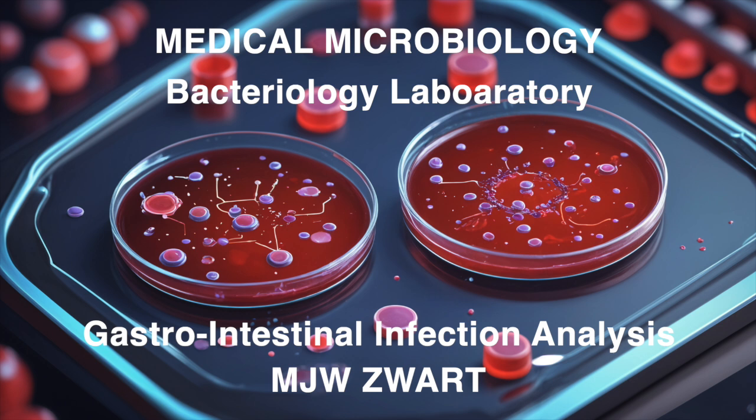Right, C. diff, it's a real problem, especially in hospitals and people who've had a lot of antibiotics. Yeah. It can be mild, but it can also get really bad. Absolutely. Given the patient's history and symptoms, we'd order that PCR test specifically for C. difficile. And if it's positive? Then we need to make sure it's actually producing the toxin. So we'd culture the stool on special media like CCFA agar that helps C. diff grow and keeps other bacteria in check. Gotcha. And of course, sensitivity testing to guide treatment. Exactly. Finding the right antibiotic for C. difficile is crucial. Okay, ready for another one?